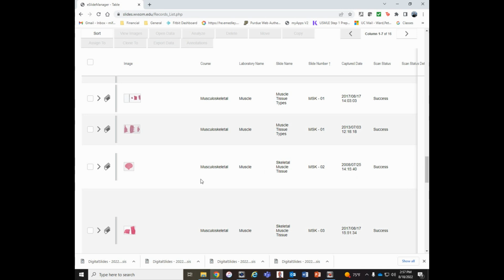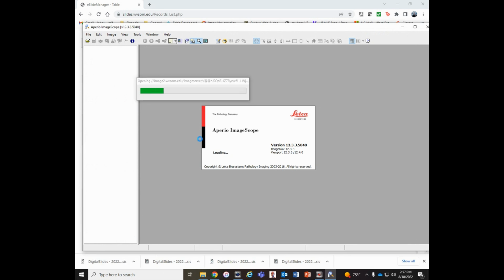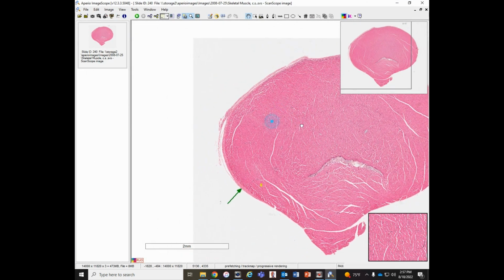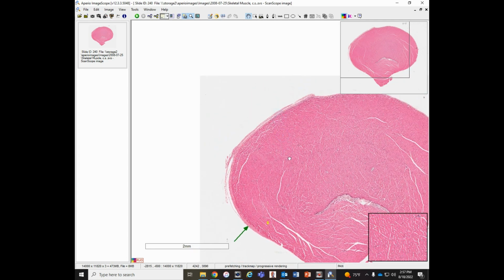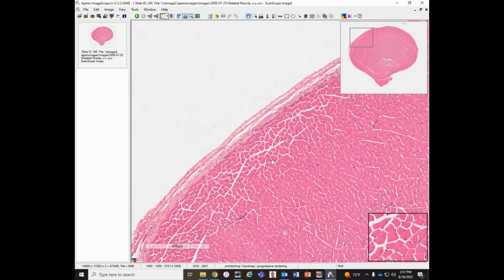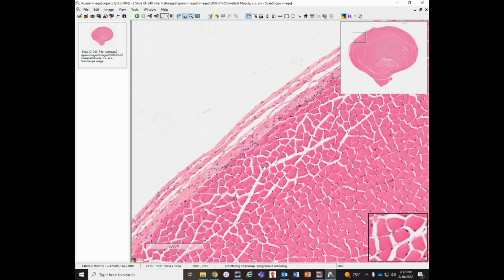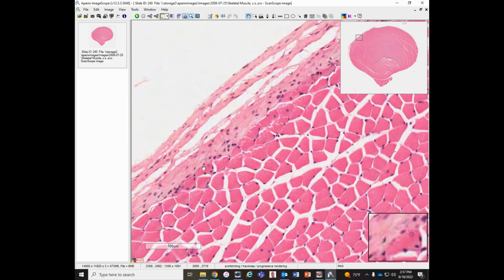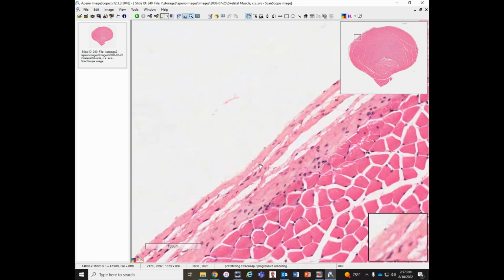Because muscle and its components are so important, we're going to hit some of those same features on another slide so that we can see how they are laid out and how those features work. Now, one thing I do want to note here that we didn't see on the prior slide is that muscle has connective tissue just like the nerves did. We have an outer lining of connective tissue. So we have collagen fibers and fibroblasts here. This is going to be called the epimysium.